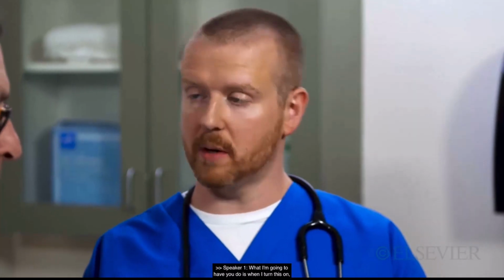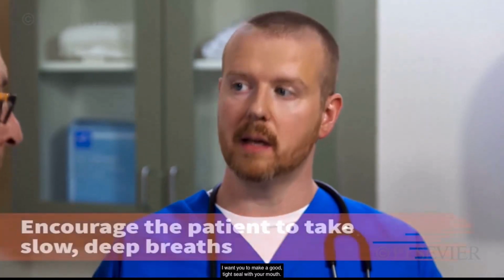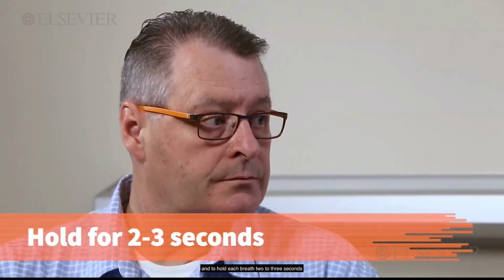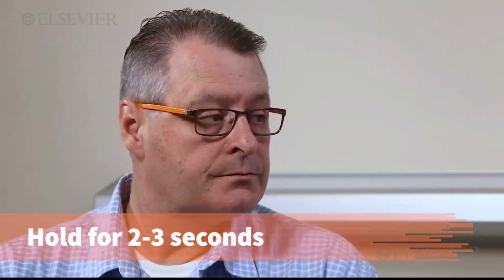What I'm going to have you do is when I turn this on, you're going to see the mist coming out. Once you make a good tight seal with your mouth, encourage the patient to take slow, deep breaths through the mouth and to hold each breath 2 to 3 seconds to allow the medication to disperse through the lungs.